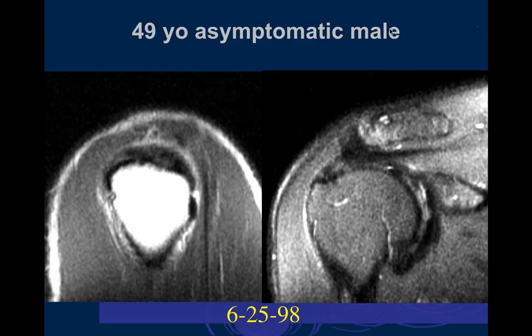Now there's also a capsule and a synovial membrane. Yeah, also there. That's right. Actually, considering the size of the joint, very thin. So you don't see it much on MRI. Right. Okay, Jeff, what do you think of this case?